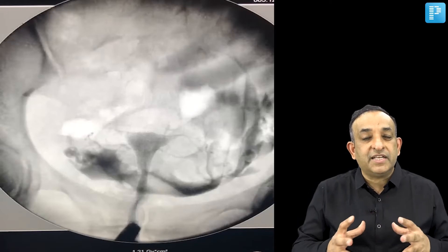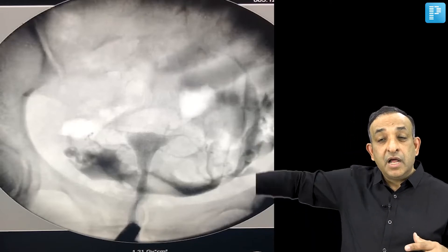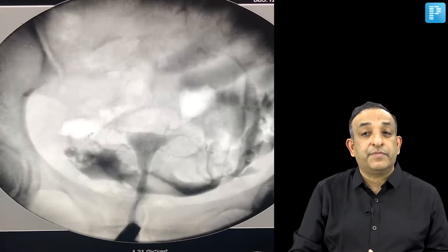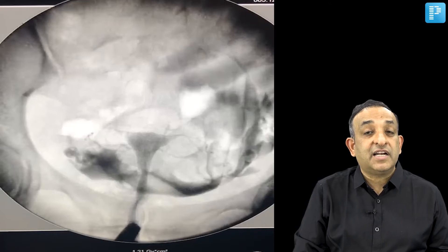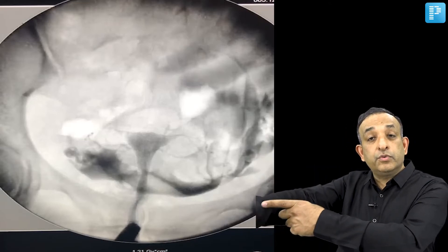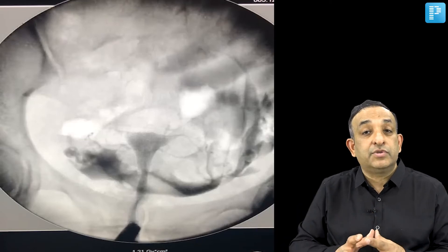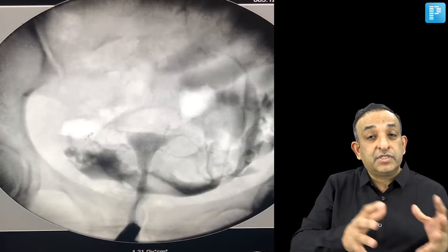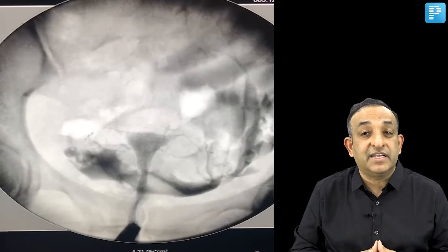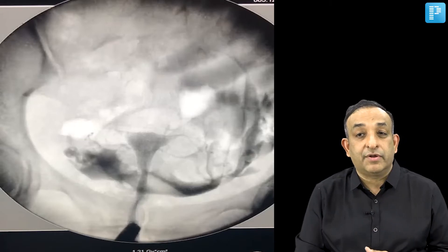But the HSG does not give a complete assessment of whether the tube is truly free. The tube needs its peristaltic motion to function — moving the oocyte toward the uterine cavity, and later moving the embryo from the ampulla toward the uterine cavity after fertilization. If the tube is stuck in adhesions, that peristaltic movement cannot happen, as was the case in this patient.